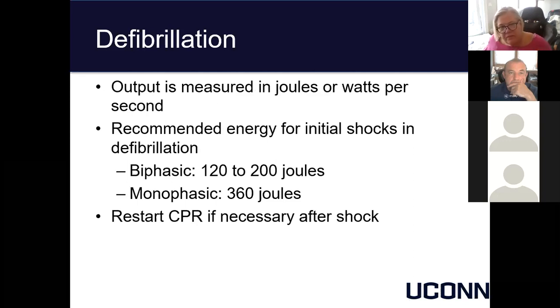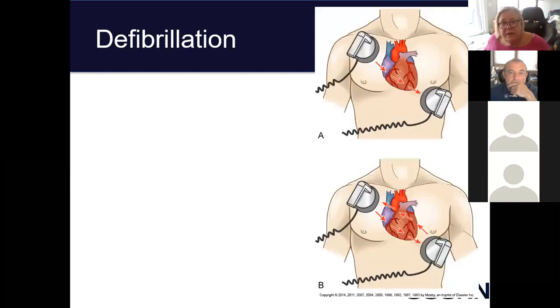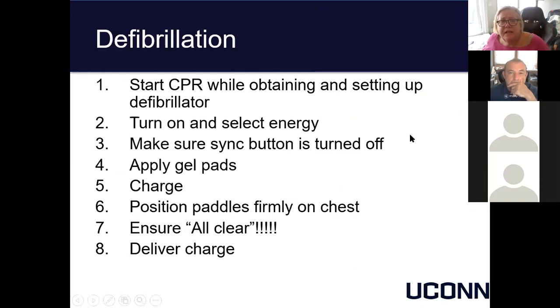So remember that whoever is providing those services keeps on going until you hear the next clear order. Then they get off the bed, get away from the bed, and the patient can be reshocked. Again, old picture. Nowadays, you roll the patient, one pad goes on the back and the other pad goes essentially in the middle of the chest, and that's how the defibrillation takes place.